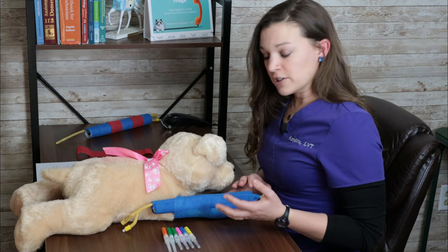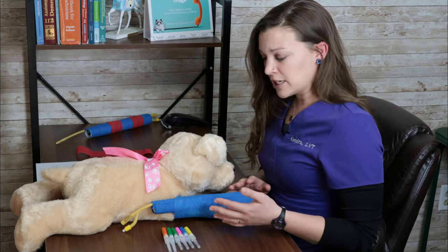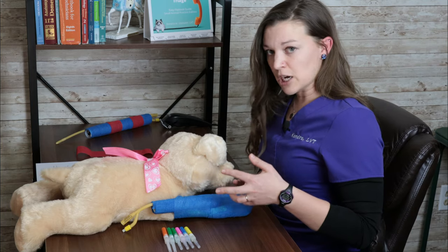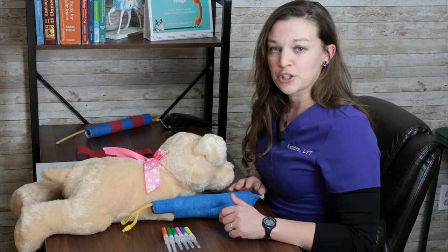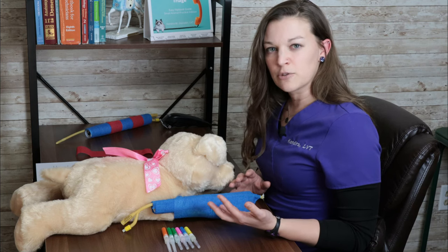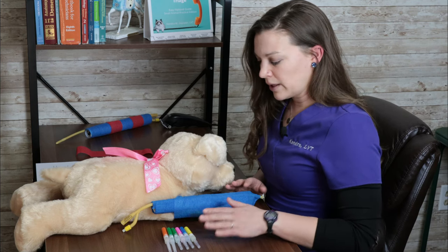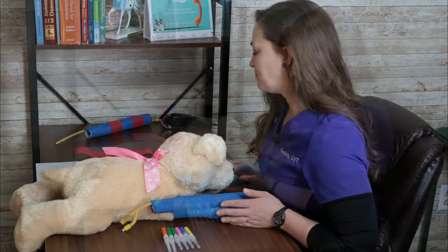So for dogs, we should be using an 18 to 20 gauge. So 20 gauge for those small, medium dogs, and then a 22 gauge for a cat, and our 24 reserved for very small pediatric patients. Sometimes, you know, with the micro and toy breeds, we might need to use a 22 gauge, but really we should stay away from those for dogs. Use the size appropriate for your patient.